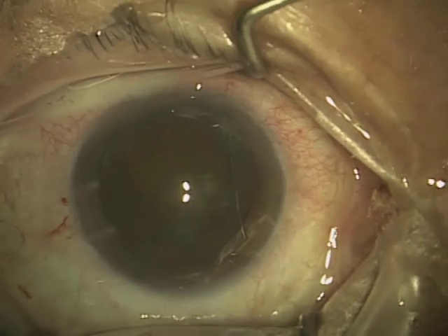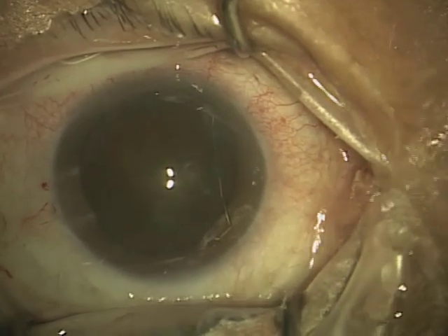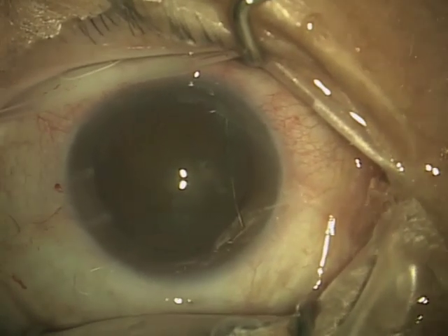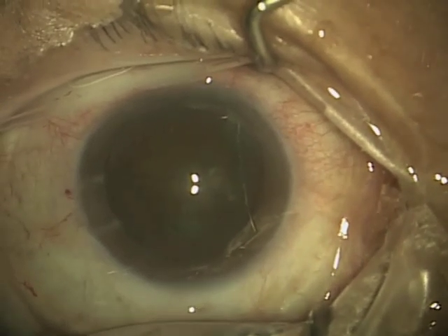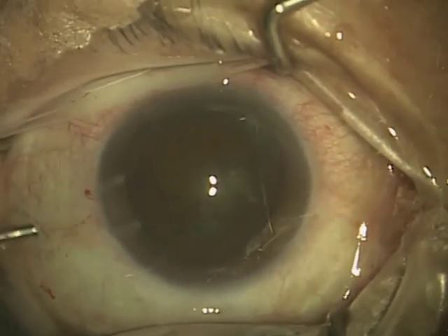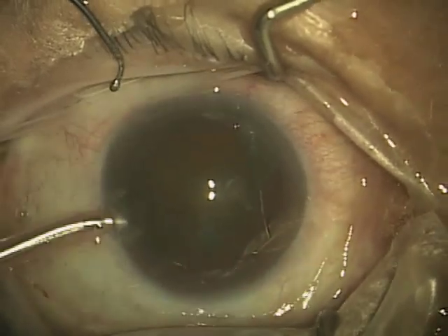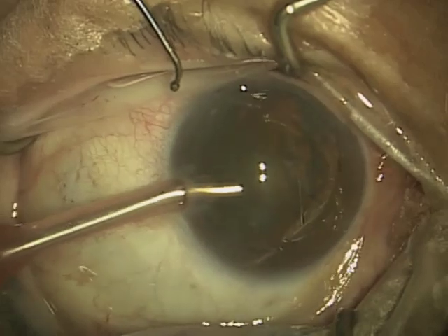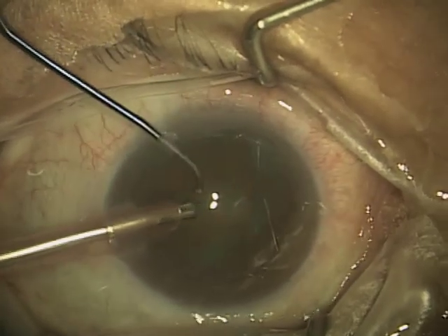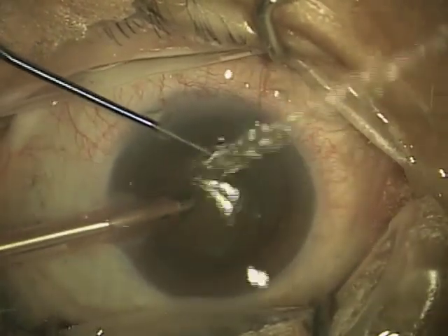Now I'm getting ready to actually start the ultrasound. You'll see that my assistant is constantly keeping the corneal surface moist so that I have a nice clear view. On the edge of this you see the phacoemulsification tip — that is the ultrasound device I'm going to use to remove the cataract. The tip moves very, very quickly at an ultrasonic speed, and the pink sleeve around it is irrigating fluid into the eye, which keeps the eye formed along with the viscoelastic gel.